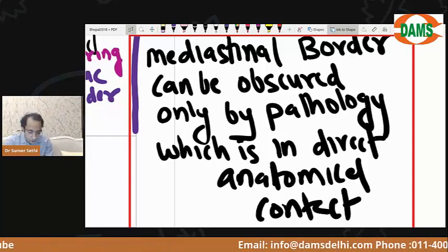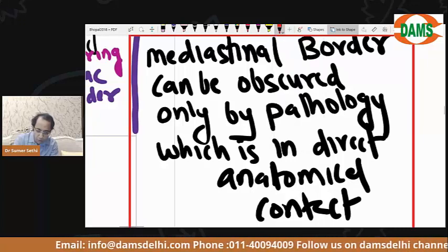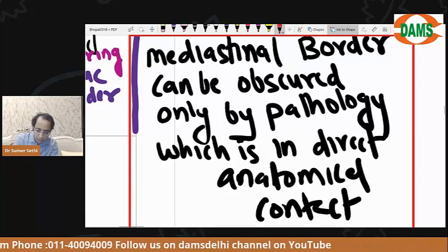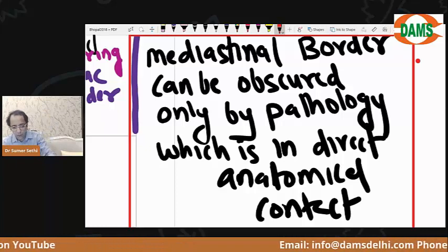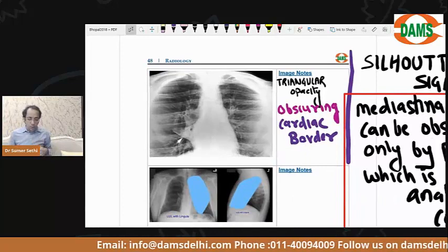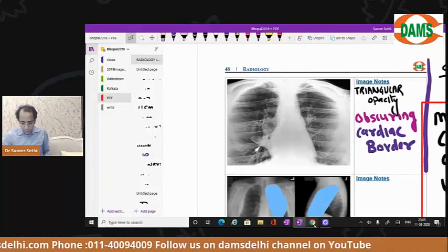Very important question. Okay, so I want your full attention. It's not easy. Chest X-ray is not an easy topic, so I want you to focus. The more you focus, the better you will learn. The more you remain diverted, the more difficult it will become. Okay, so let's try to understand it further. Now tell me. Now imagine, listen to me. I'll just remove the screen here and I will go back.